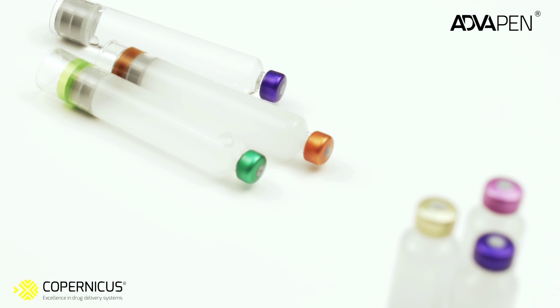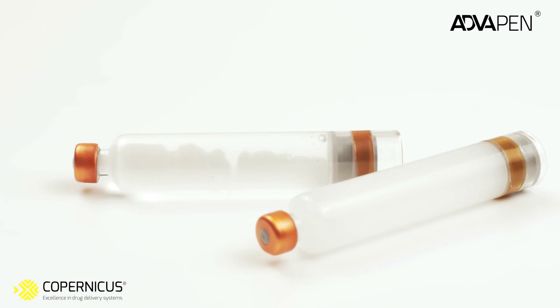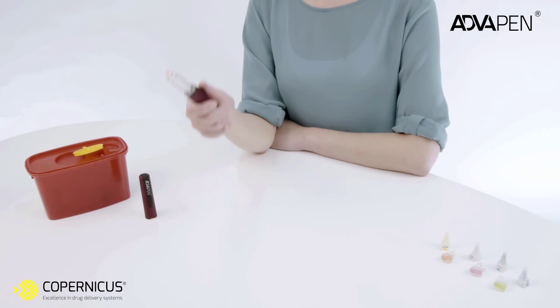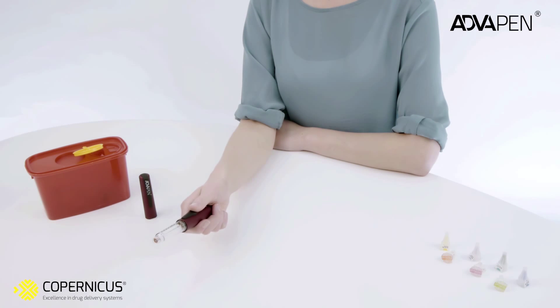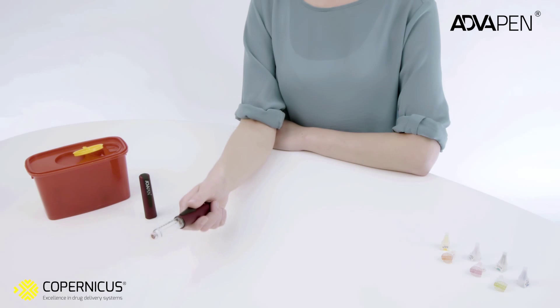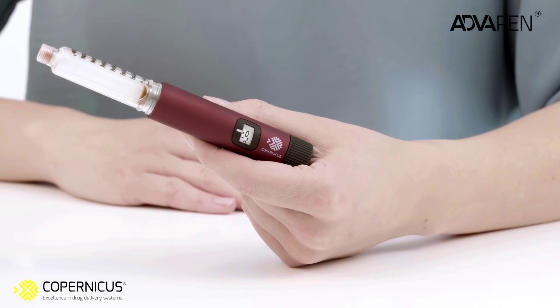Remember, you may not use any insulin other than that recommended by your doctor. Check the cartridge to make sure it contains the type of insulin you have been prescribed. If you are using a cloudy insulin, you must mix it before each injection. Mix the cartridge content by turning the pen gently up and down at least 10 times until the insulin looks entirely mixed and has a uniform appearance.